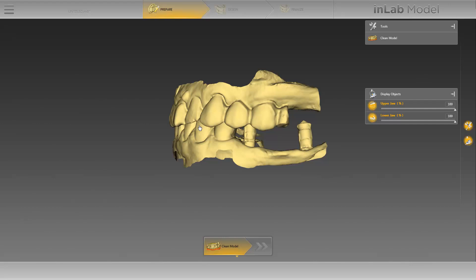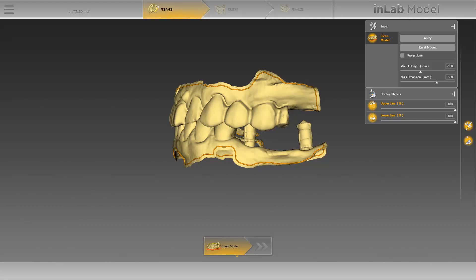The app opens as a separate application. Similar to the in-lab software, it has a phase bar and a step menu. Our case was imported automatically and we'll start in the phase prepare with the clean model tool. By activating the tool, a cut line is automatically drawn in the upper and lower jaw. This line marks the transition between the scanned model data and the future model base.